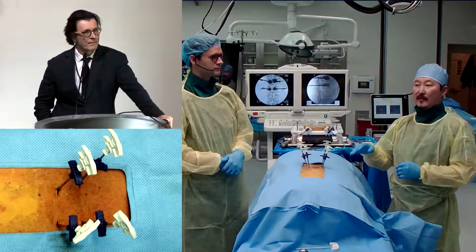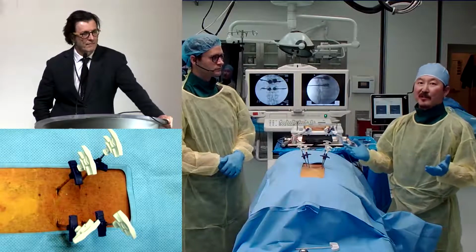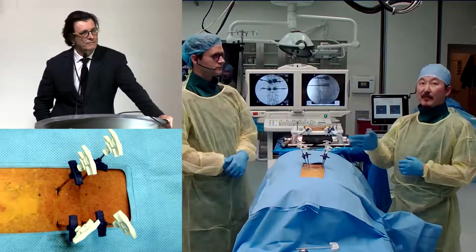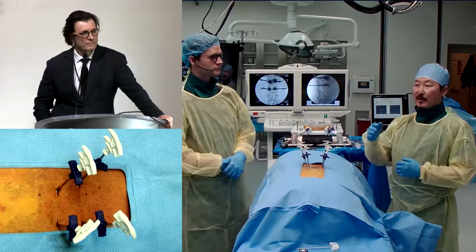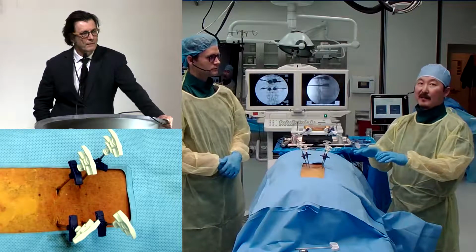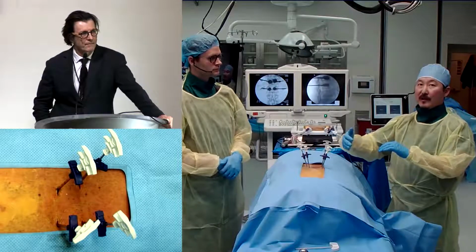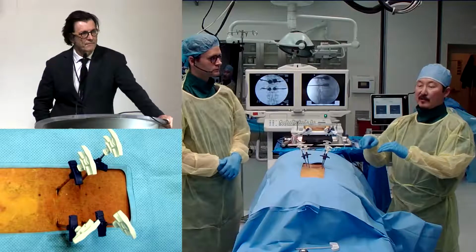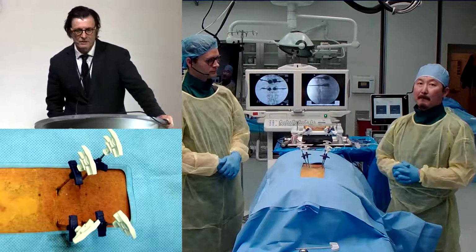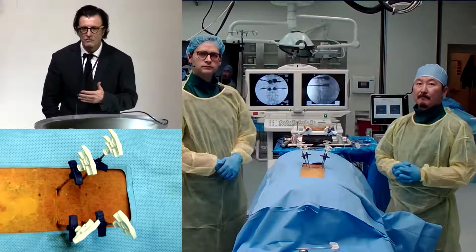I've taken out cement before, and it's like having a central disc herniation, essentially. But the zone is a little different because it's not at the disc space level; it's at the vertebral body level. In reality, the PLL is still intact, so you can do a laminotomy, retract the neural elements over, make an incision over the PLL, and extract the cement. Most of the time the cement is behind the PLL, so the likelihood of symptoms is very low.